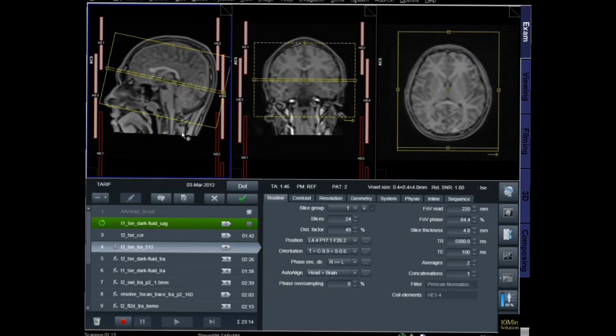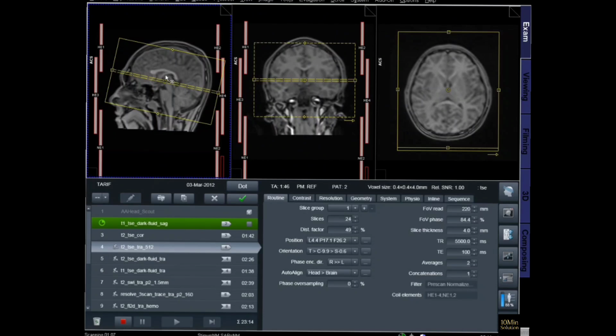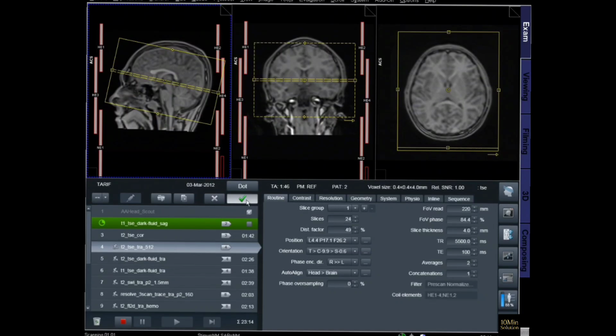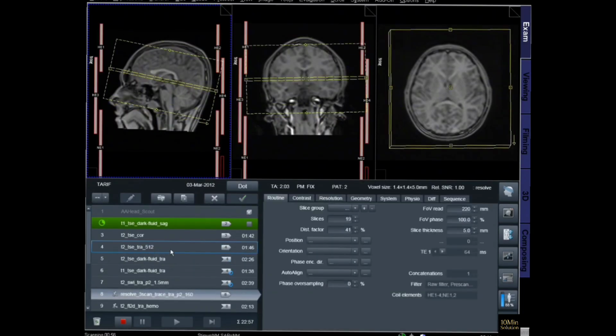The patient is instructed to remove all metallic objects, such as jewelry, watches, eyeglasses, and hairpins before entering the MRI room. Patient positioning. The patient is positioned in the supine position on the MRI table. The head is placed inside the head coil, and proper immobilization is ensured to reduce motion artifacts during scanning.